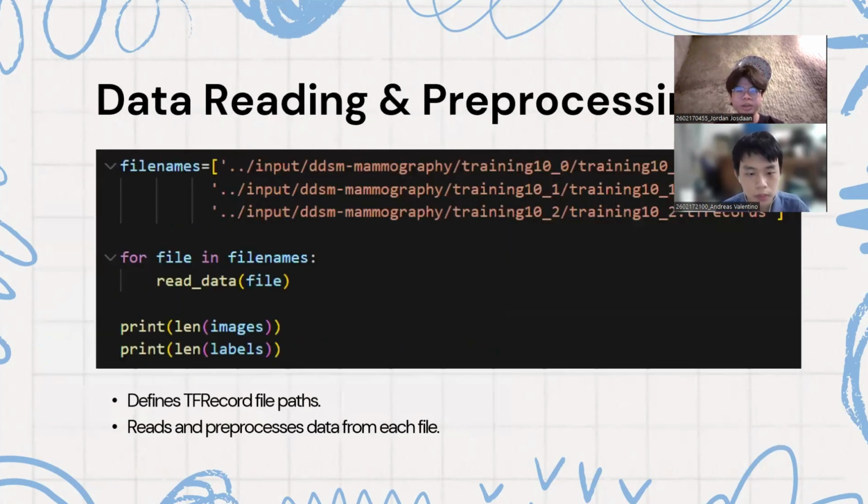Okay, so here's the code to define the file path. Then we call the read data function for each TF record file in the mammography dataset to read them all and preprocess the data from each file.